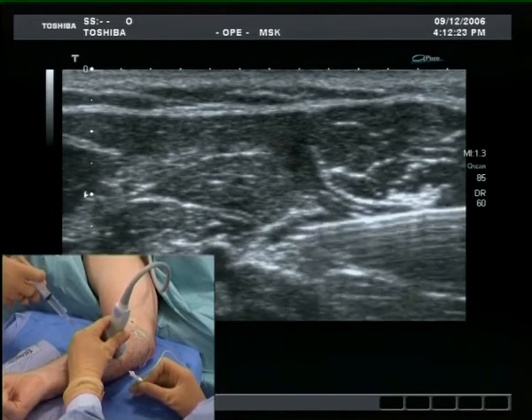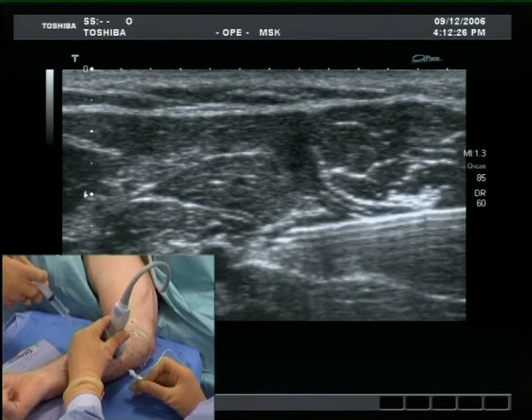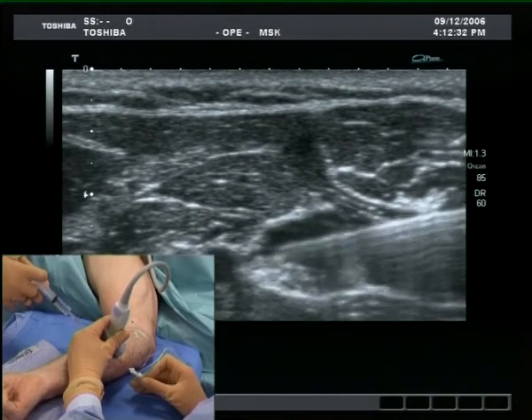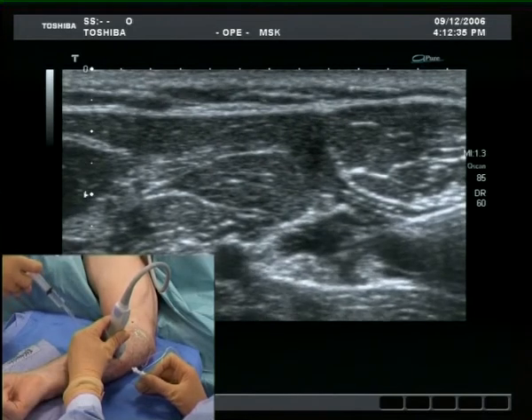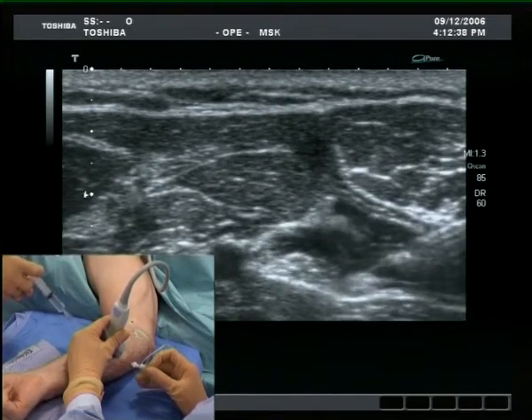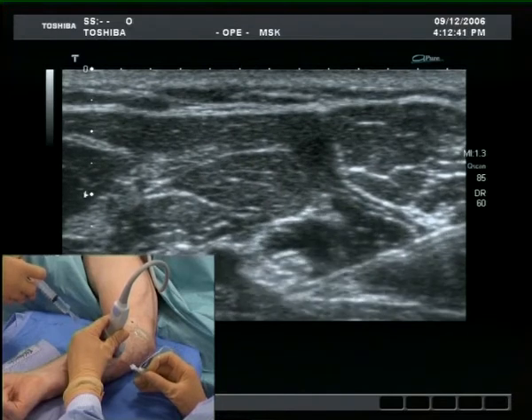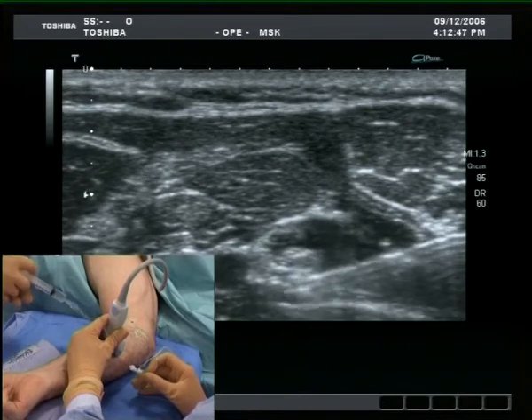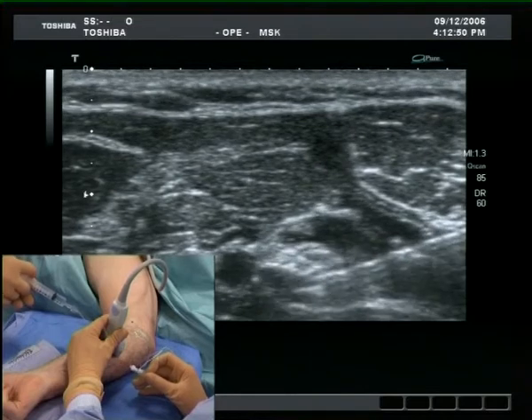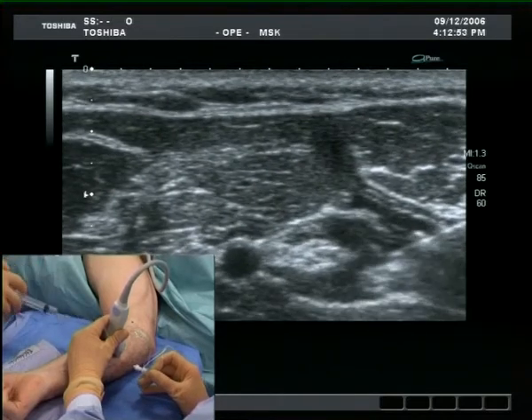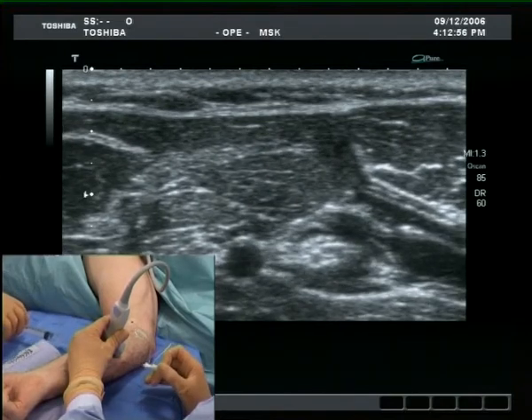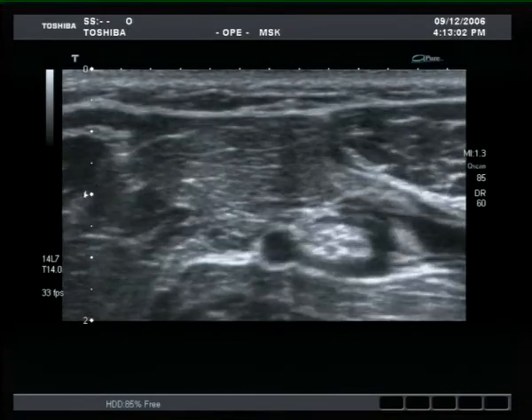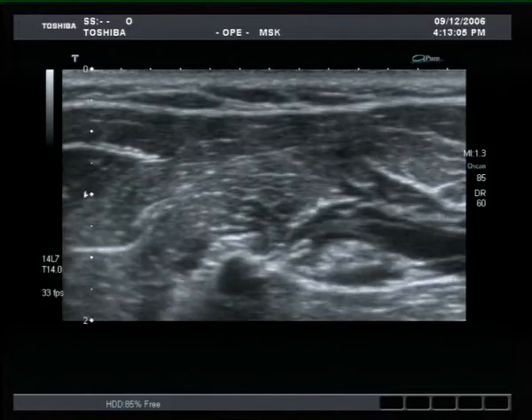For small peripheral nerves, it is probably not absolutely necessary to demonstrate fully circumferential spread of the local anaesthetic. Moving the probe up and down from the injection site allows assessment of the spread along the long axis of the nerve and reassures the operator that the block will be successful.